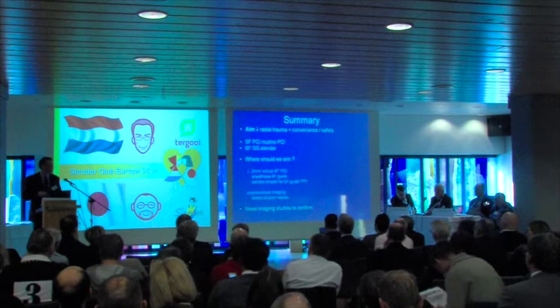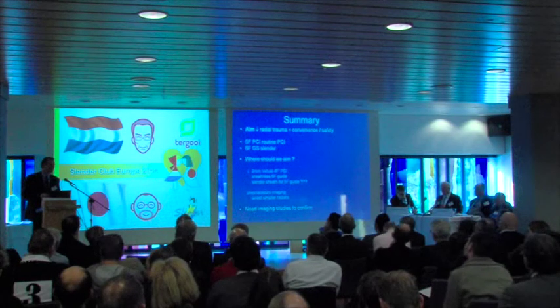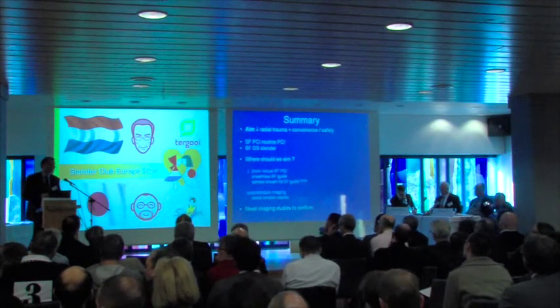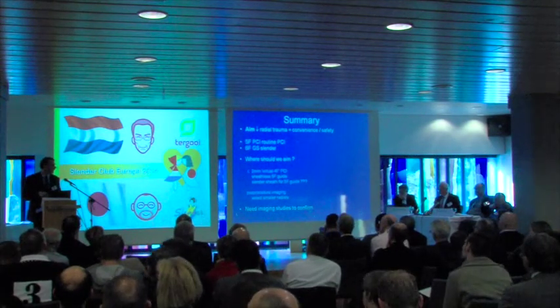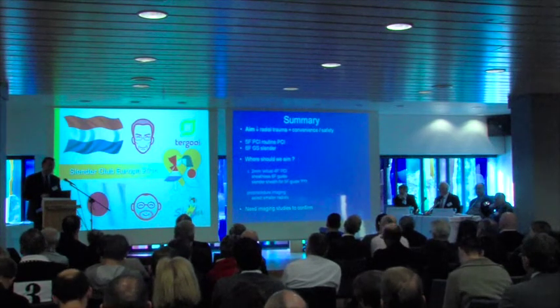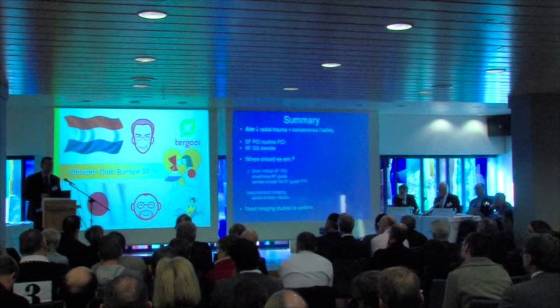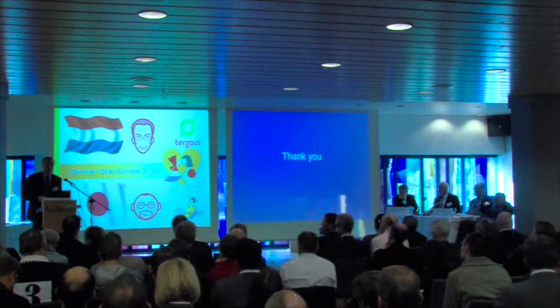Perhaps there's also a rationale, as I say, because of the variation in radial size, to be doing pre-procedure imaging and matching our equipment size to the radial artery lumen. And certainly there's a need for further studies to prove benefits of new systems, in particular in relation to radial artery trauma and radial artery occlusion. Thanks very much.